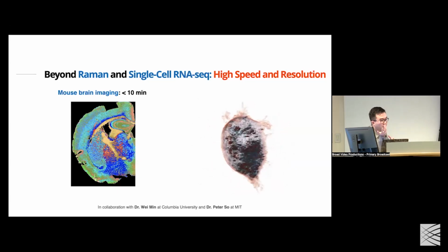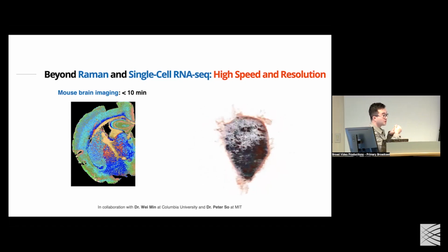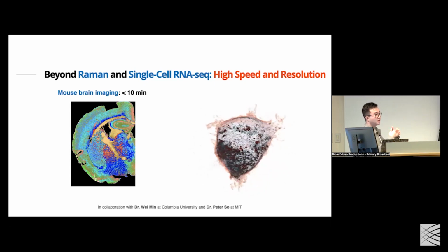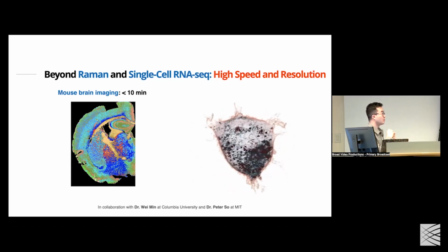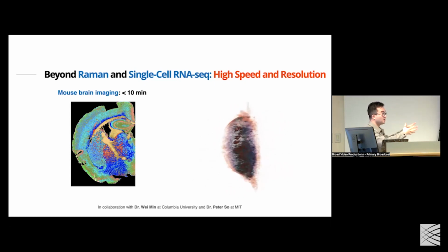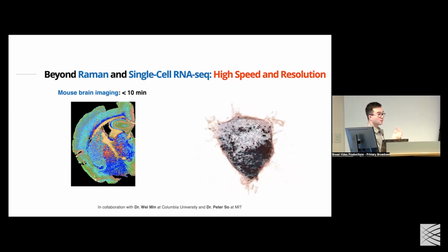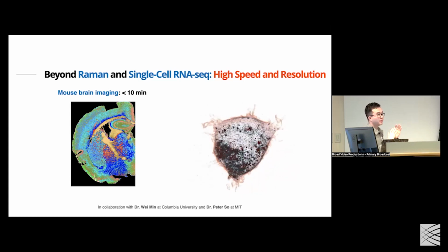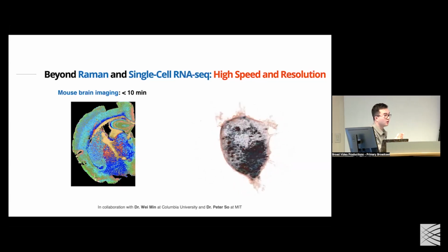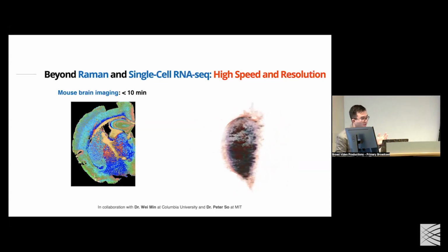We tried Raman, we tried H&E, because each imaging method captures different kinds of features of the cell state. For example, Raman microscopy captures the chemical information inside the cell, and histology captures morphology information. But thinking about the causality here, actually, gene expression will be the upstream, and as a result of the gene expression program, the cells will have different morphology. They will have different kinds of molecules inside the cell. So we're measuring some of those features, but we don't know what is the right combination of different kinds of imaging measurements right now. That's why we're testing different kinds of imaging methods.